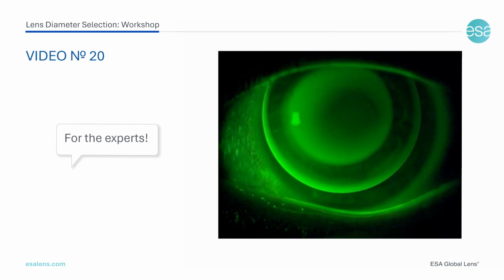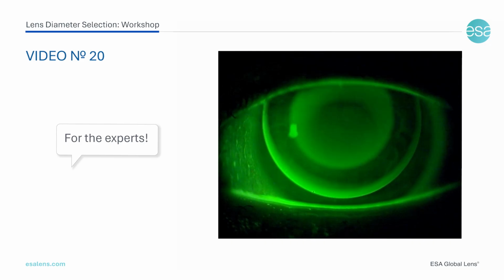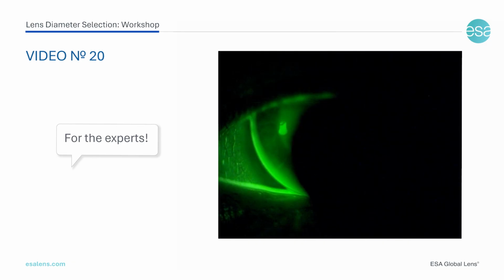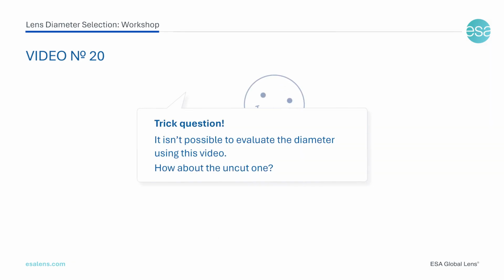What do you think of the diameter of this lens? What is your proposed action? That was, of course, also a joke. In reality, it is impossible to determine the diameter from a video like that. This is because the last frame was cut. Now let's watch the uncut footage.